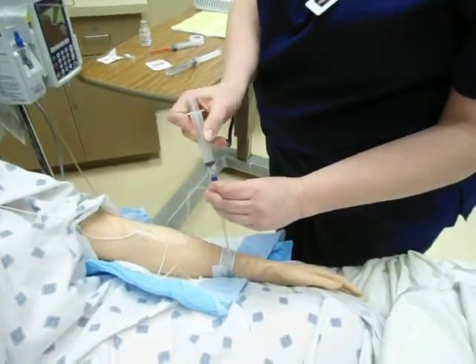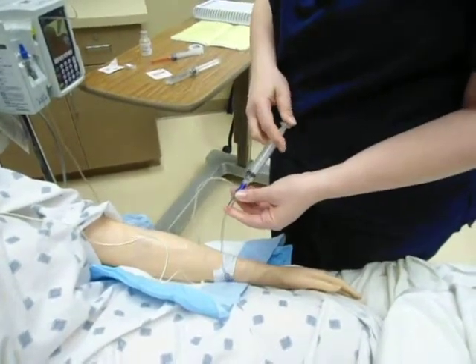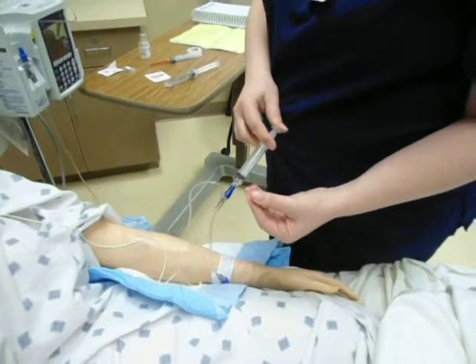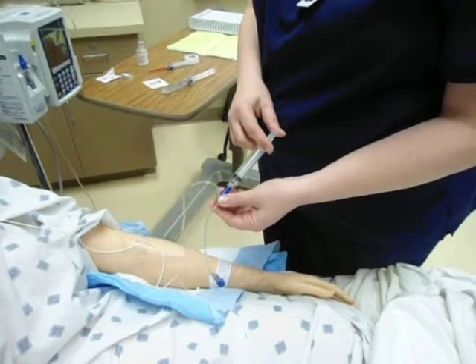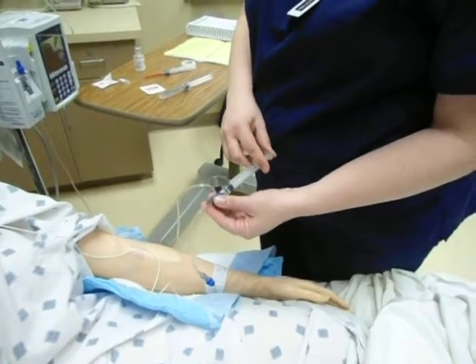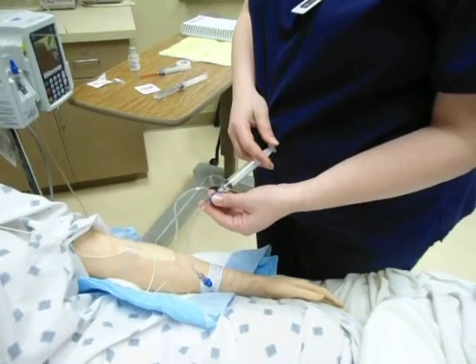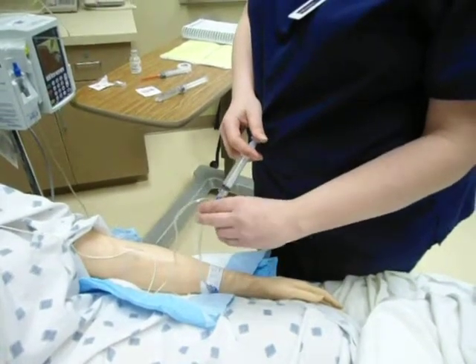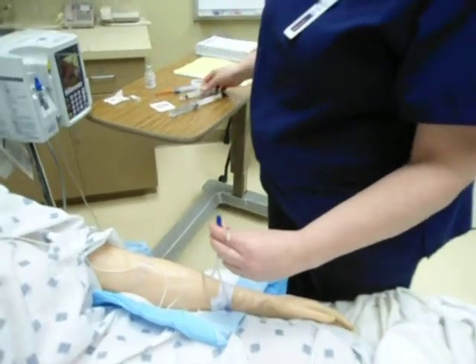Got the medication on, and now over 3 minutes I have 1.5 milliliters in here, and over that 3 minutes I'm going to put in 0.5 milliliters over a minute. So when I'm done doing that over the 3 minutes, take it off.